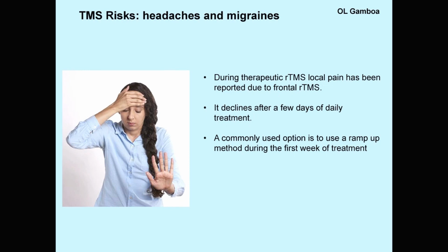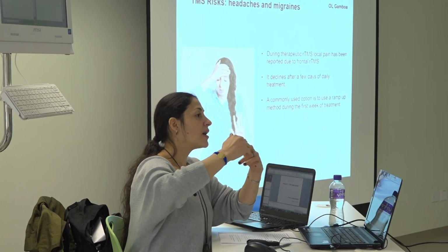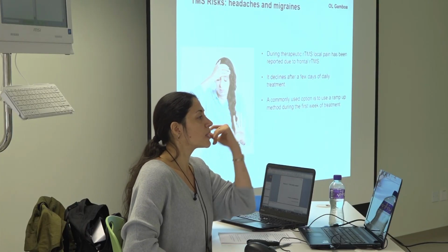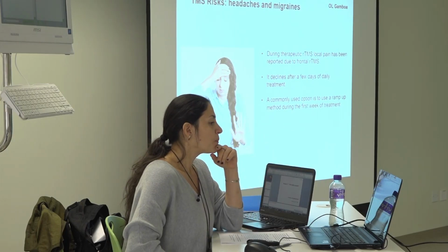During therapeutic rTMS, there are many sessions, right, applied over several days, with long sessions depending on the protocol. They have reported frontal pain due to rTMS, because you have these twitches. The protocols I have used are for research and are 15, 25, or 30 minutes, and I haven't had that situation. The pain is there initially, yes, but then it passes.